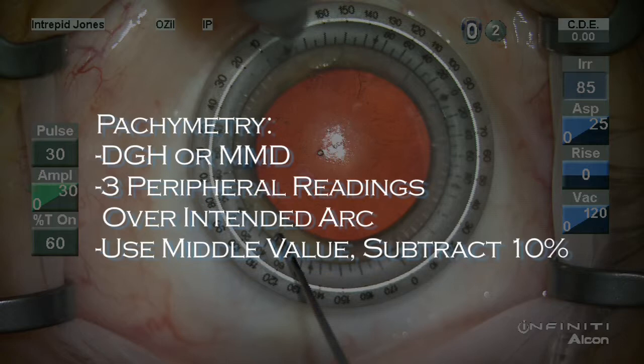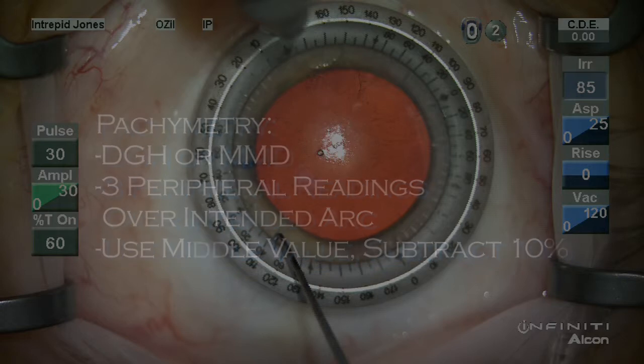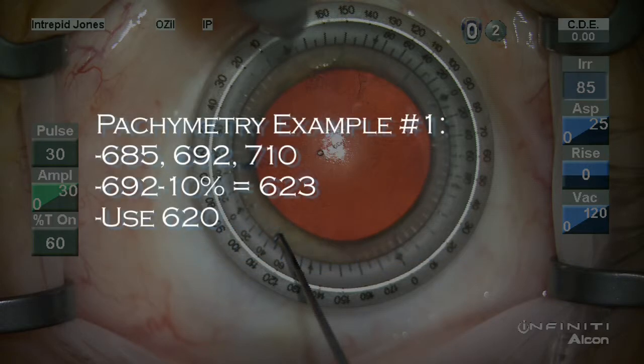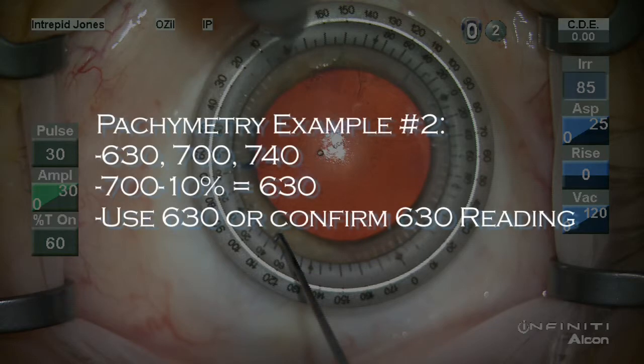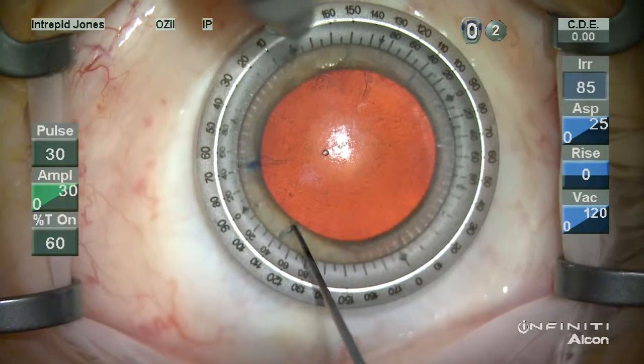Pachymetry is important, and I use a DGH or MMD device, which will measure peripheral readings well and get 3 readings over the intended arc. In this case here, for an example, we have a middle reading of 692 minus 10% gives us 623, and so I'm going to use 620. In this example here, 10% off the 700 middle value will give 630, so I'll either use 630 or I'll confirm the 630 reading.